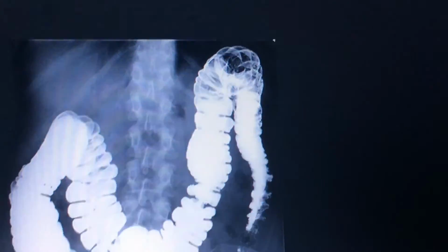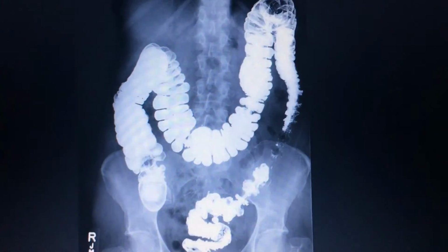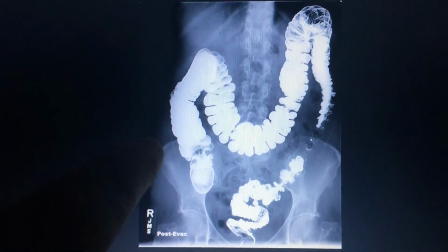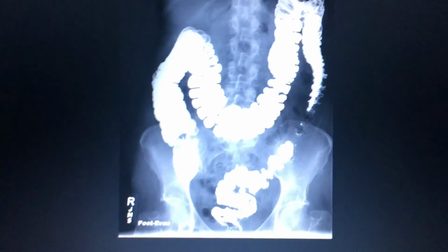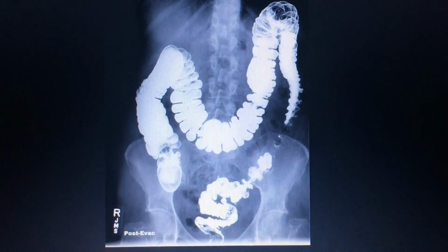Some diverticulum. Left colic flexure, right colic flexure, transverse, ascending, descending colon. And that completes my eval for my pictures.